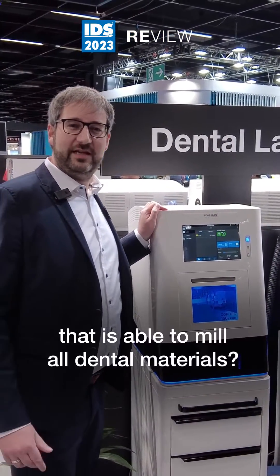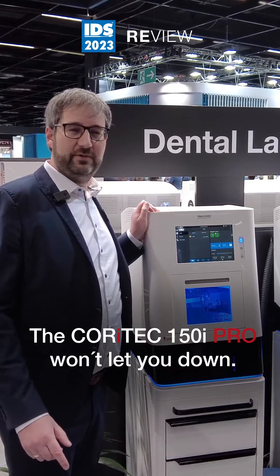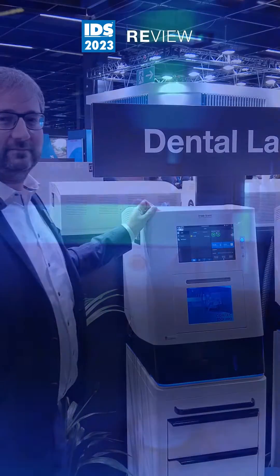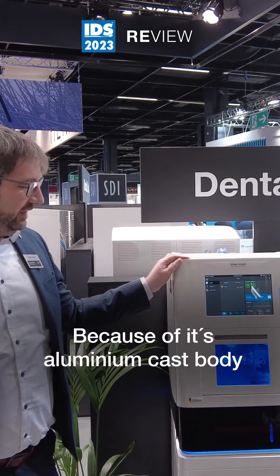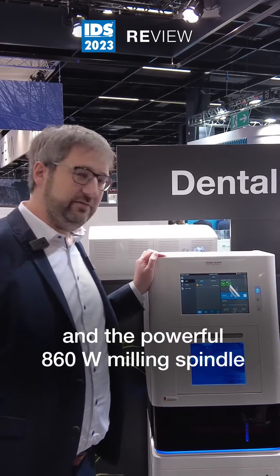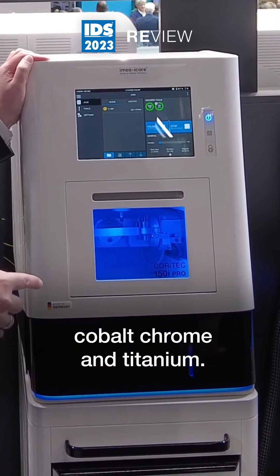Looking for a compact milling machine that is able to mill all dental materials? The Coretec 150i Pro won't let you down. Because of its aluminium cast body and the powerful 860 watt milling spindle, this small machine is also able to mill cobalt chrome and titanium.